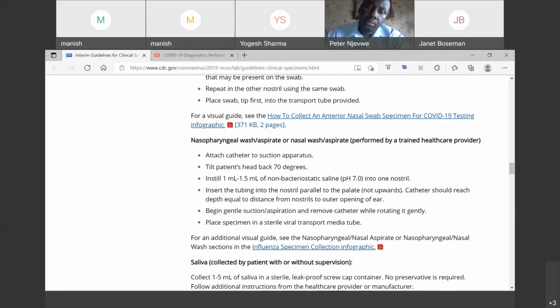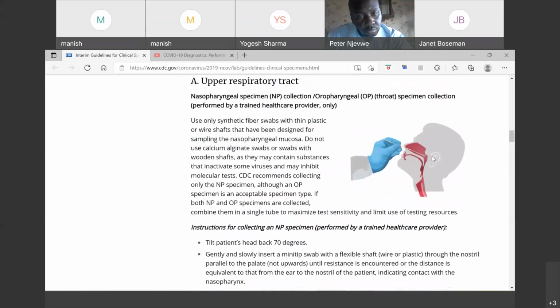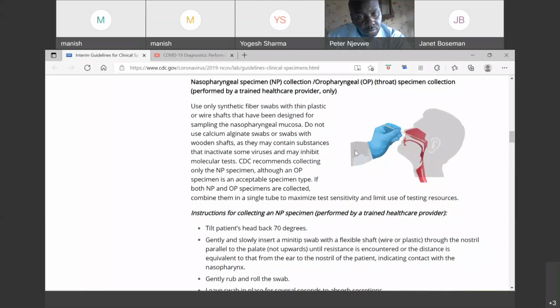Instill 1 to 1.5 ml of non-bacteriostatic saline, which means it is sterile, with a pH of 7, into one nostril. Insert the tubing into the nostril parallel to the palate, not upward, as I explained in the swab. The catheter should reach a depth equal to the distance from the nostril to the outer opening of the ear, as I showed you in one of the photographs. You can see here, the depth should be the same. The catheter needs to be inserted up to that depth.